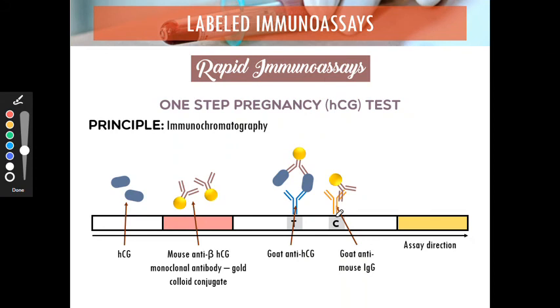In the insert itself, they explain what reagents are there, like is it mouse anti-beta HCG, or is it goat anti-mouse IgG. So it is already explained there.